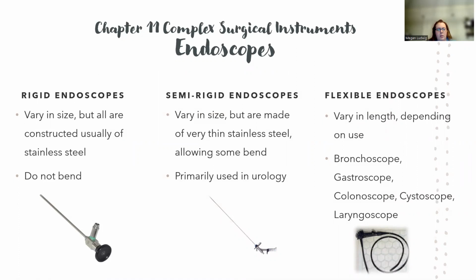So endoscopes are definitely complex because there's, for one, a lot of different types of scopes that have to be sterilized a specific way. And scopes in general are very expensive. So we want to make sure that we're taking good care of these to prolong the life of the instrument, help save the patients and the hospital money by keeping those sterilized and cleaned properly.